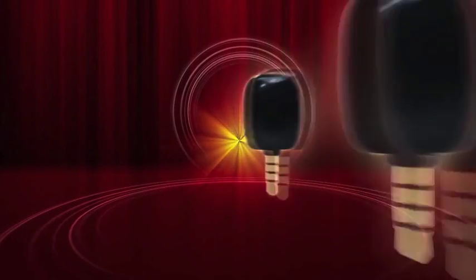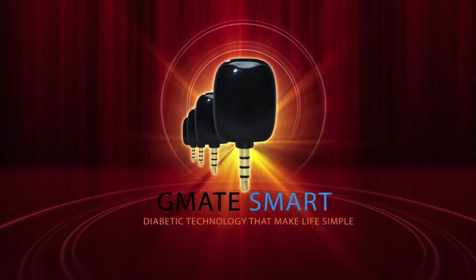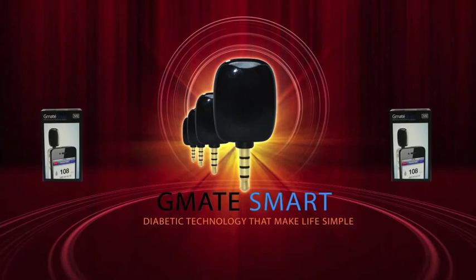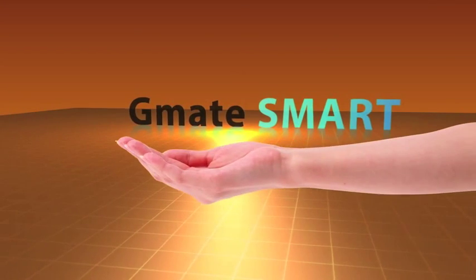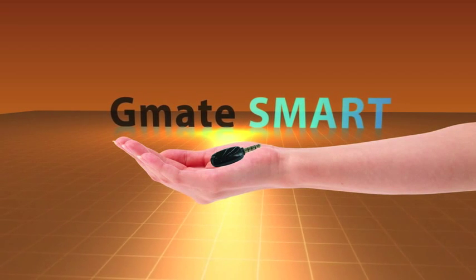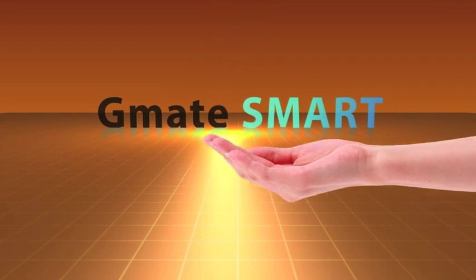The G-Mate Smart Glucose Meter is the only true smartphone glucose meter to connect directly to the iPhone without the need of a costly adapter. The first in its class and weighing in at less than 2 ounces, the G-Mate Smart is the smallest, most innovative blood glucose meter in the world.